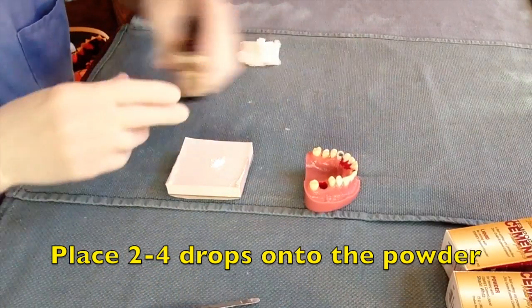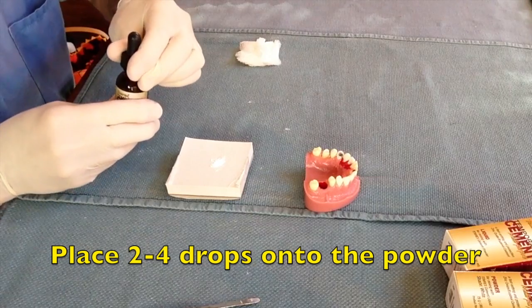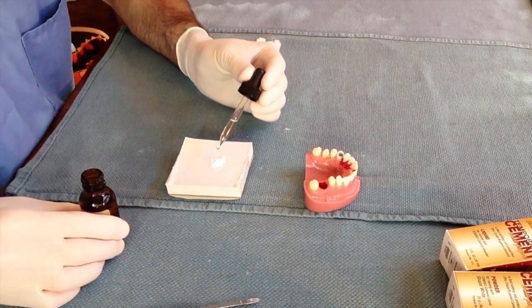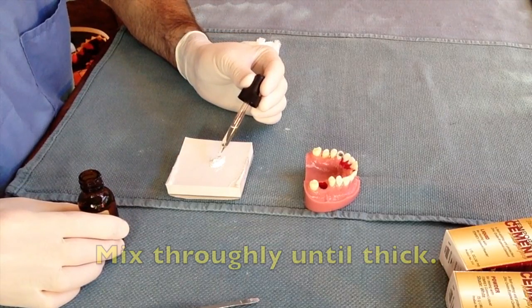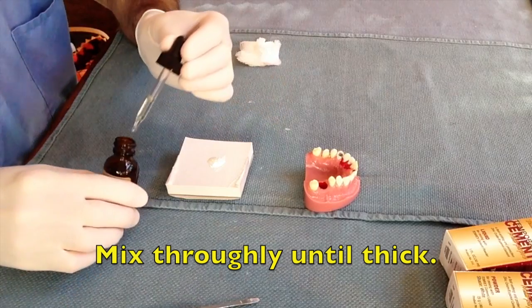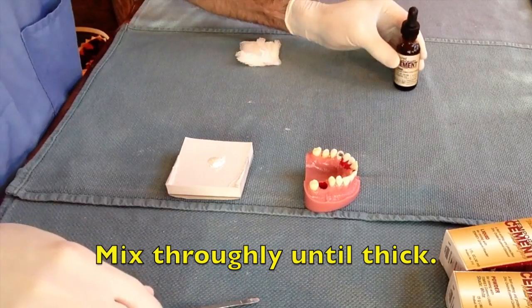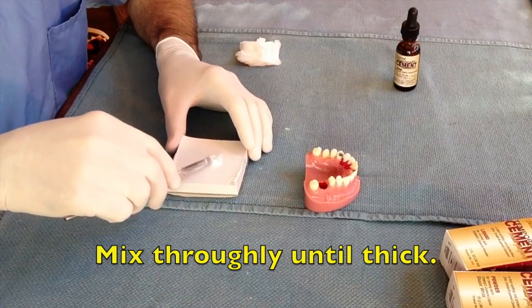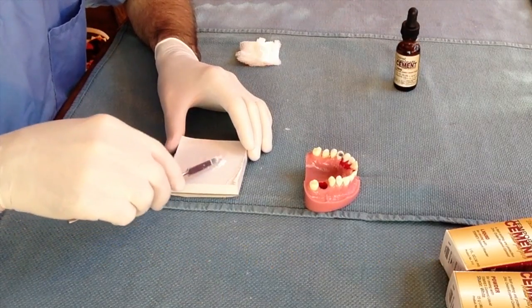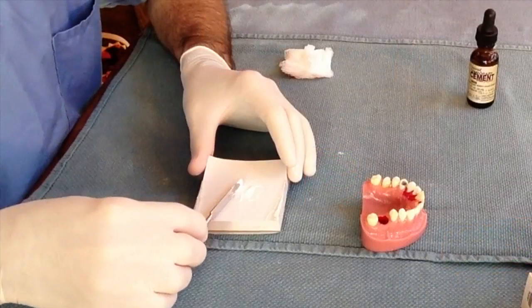Next, place approximately 2 or 3 drops of the Temerex liquid onto the mixing pad. Mix the two together with the spatula. Continue to mix until the cement is roughly the consistency of toothpaste. It should be thick enough to not drip off the spatula. You may have to slightly adjust the amount of powder or liquid you're using to get the appropriate consistency.